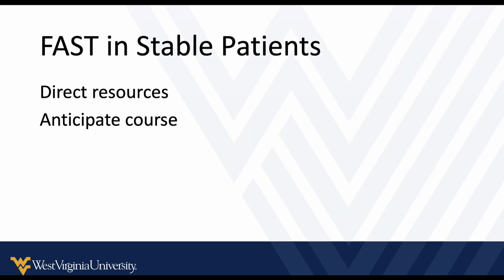So in stable patients, the FAST exam can help you direct resources. So the patient who's stable but has a positive FAST exam, you've got to put them in the sicker category. So that patient gets the second IV. They need the nurse to travel with them. They probably need the cooler of blood to be traveling with them. And if anything happens between that FAST exam and whatever you're next doing, maybe they're going to CT scan, then you can kind of stop the CT scan and divert directly to the operating room.